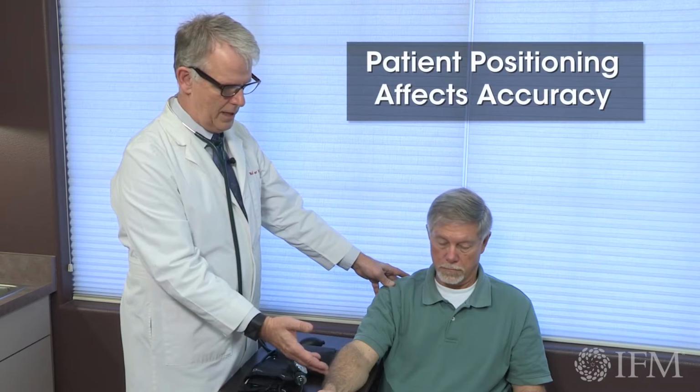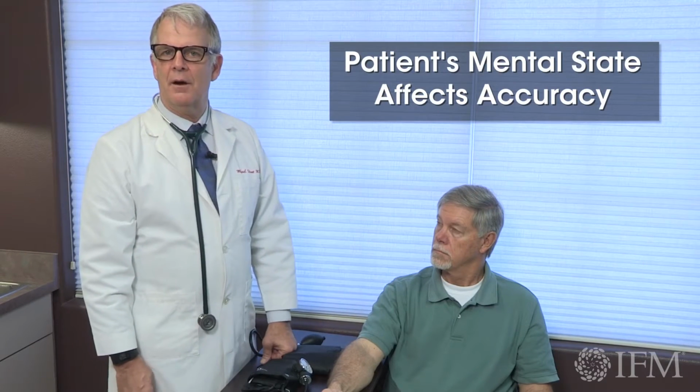The aneroid, or the manual cuff, is challenging because, much like we've demonstrated in this series, it requires the clinician, whether it's a nurse or a health aide or the physician, to know the proper way that the patient is supposed to be sitting. Feet on the ground, back supported, comfortable, not rushed, not tachypneic, and in no distress. Don't forget to consider the state of the patient. Are they stressed? Do they look stressed? Are they sweating? Are they breathing fast? Are they having phone calls going off in their pocket all the time? All those things raise our blood pressure. So when you take a blood pressure in your clinic, you just need to take all those things into consideration before you even place the cuff.